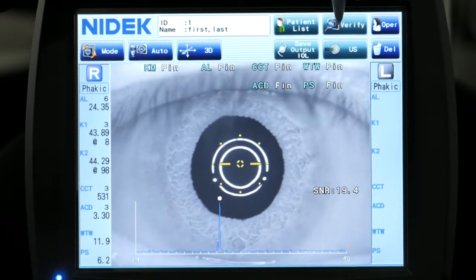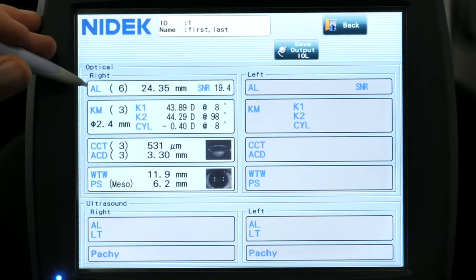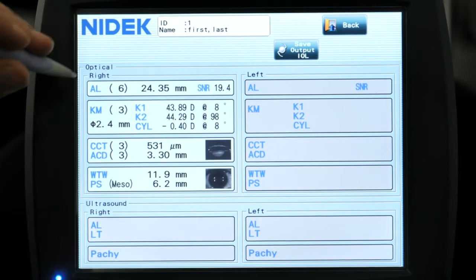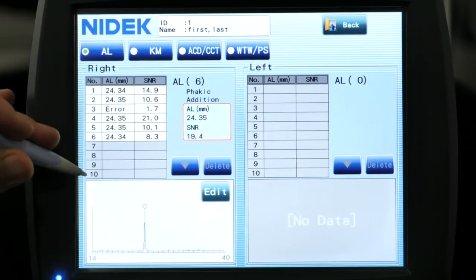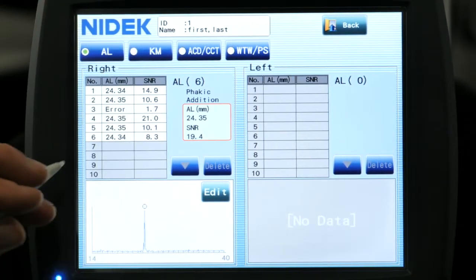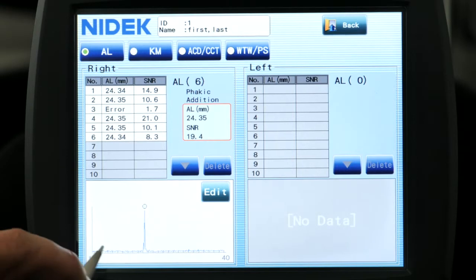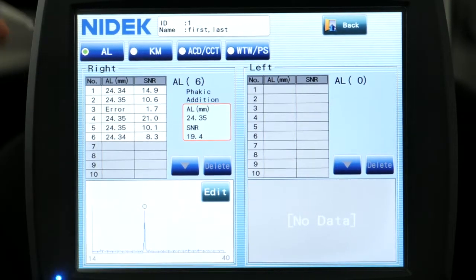At this point, you can just verify your measurements if you want. So you can select axial length here and it's going to show you your axial length measurements. It's going to select the one that's got the higher signal-to-noise ratio for you already.